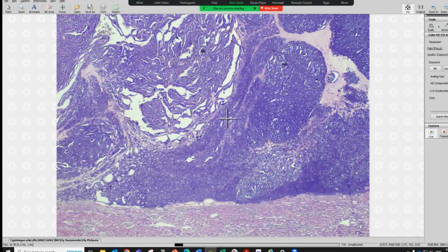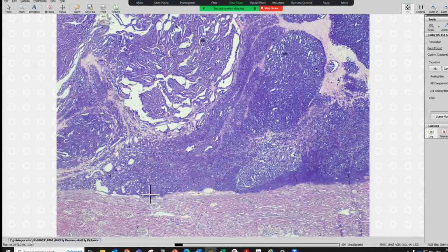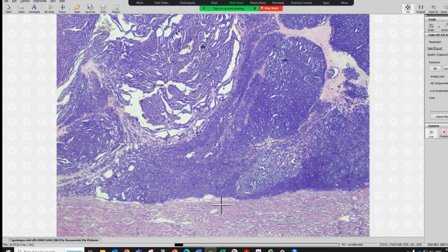Yeah, clear cell, but clear cell is so rare. I don't think anyone will think of clear cell carcinoma first, right? If you do not know this is an adult, we should also think of Wilms tumor, nephroblastoma. So when you see papillary structure, these three are really good differentials. Of course, other tumors, maybe neuroendocrine, can have a really rare variant to form papillary structure, but we always need to think of the common things first. So always think of these three common diagnoses when you see the papillary structure.